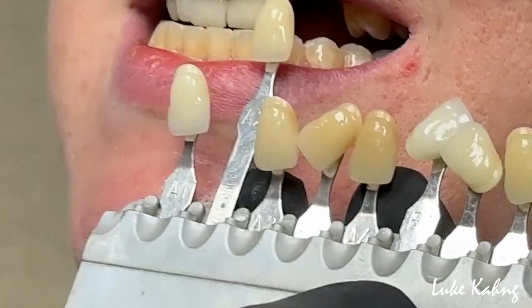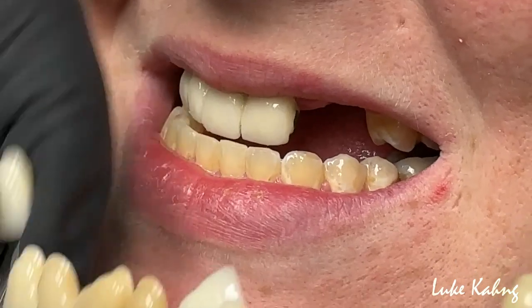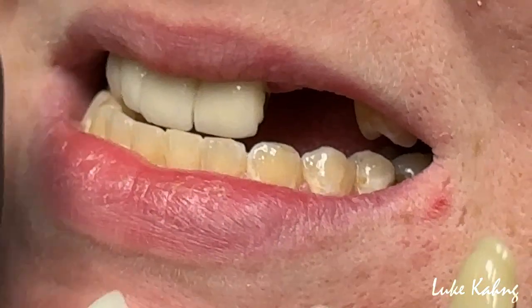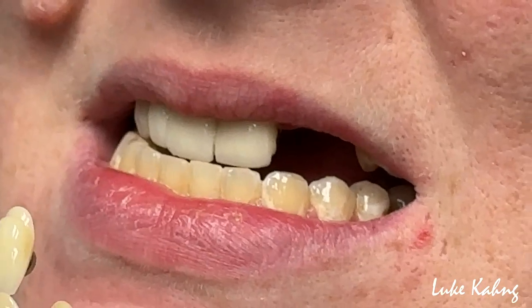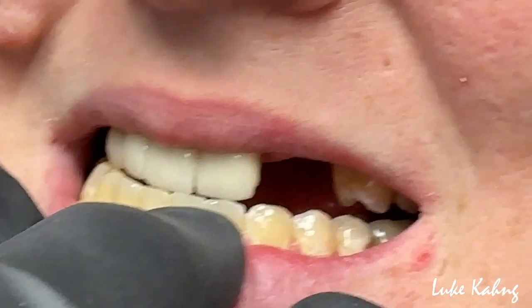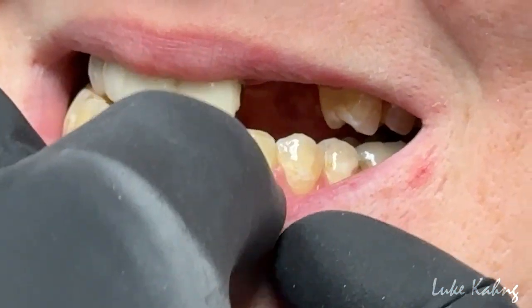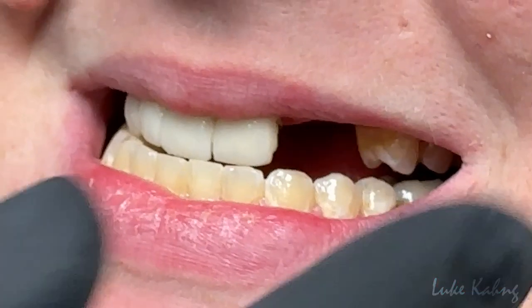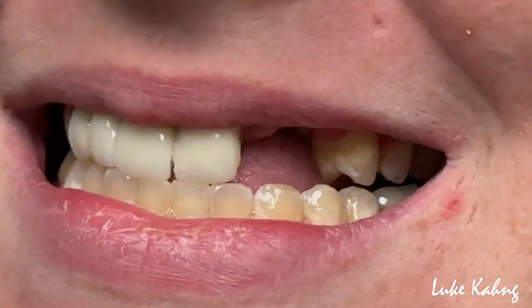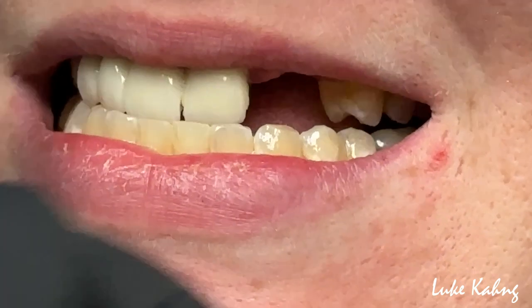How about this? You like it? Yeah. Okay, so this is too light, this is too dark. You like this one? Yeah. I'm going to choose A2 and then put a little bit more gray-blue-white inside so I can mimic that. I'm not going to follow the Vita shade classification. Make sense? Yes. Okay, so that's the starting point — we're trying to match with this, basically making A2.